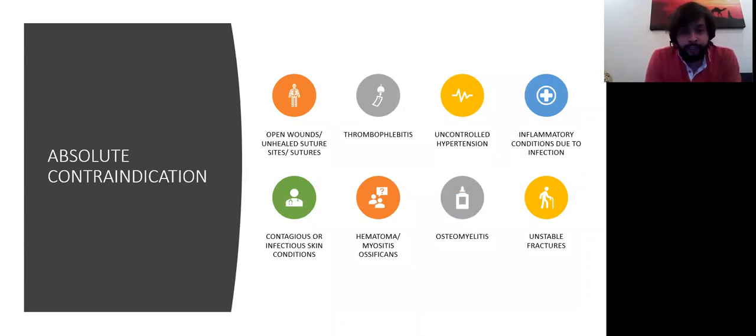Absolute contraindications. Open wound, don't use it. Thrombophlebitis, uncontrolled hypertension, inflammatory conditions due to infection, contagious or infectious skin conditions, hematoma, myositis ossificans, osteomyelitis, and unstable fractures.